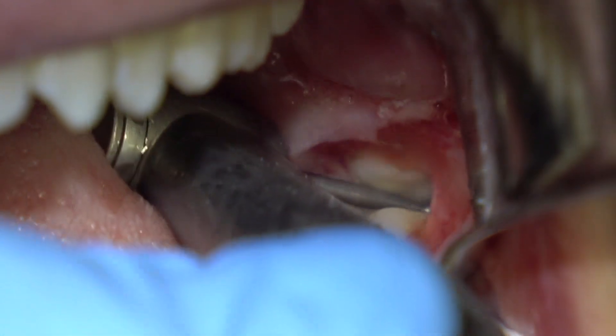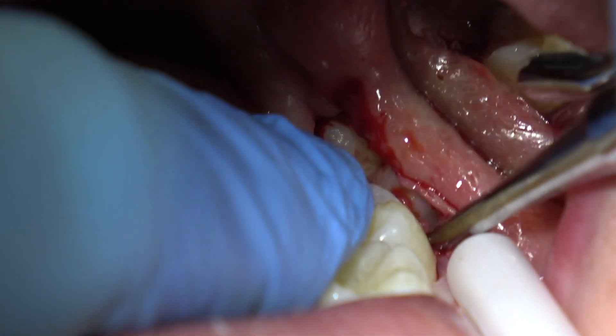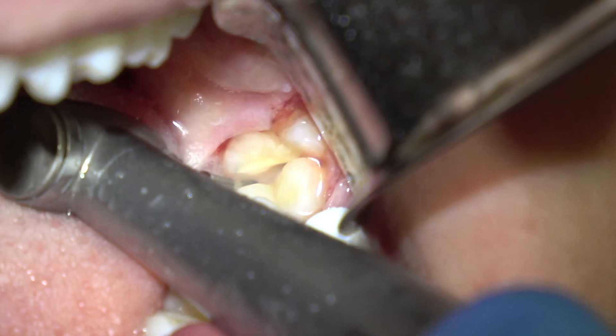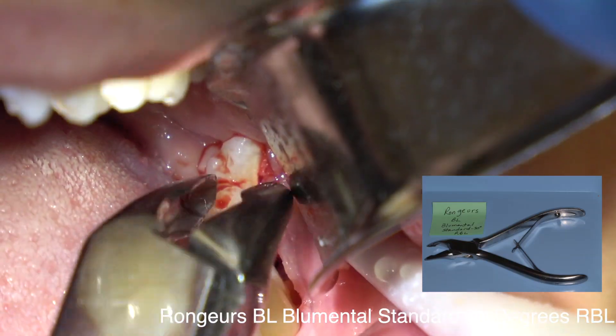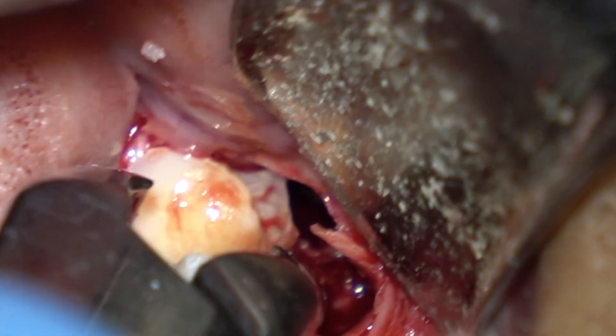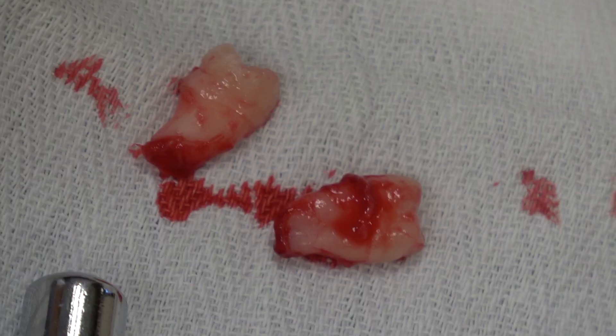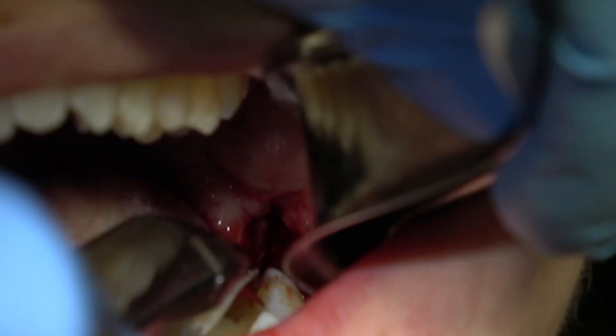I didn't cut all the way through the furcation, so I went back and cut all the way through. Be careful not to cut past the furcation in this case, because you don't want to damage the inferior alveolar nerve. Here comes that distal piece — remove it with the rongeurs, then come back and elevate the mesial piece into the space created by removal of the distal half of the tooth. Be sure to protect the airway with a two-by-two gauze or your mirror. Now I'm removing the follicular sac with my rongeurs.